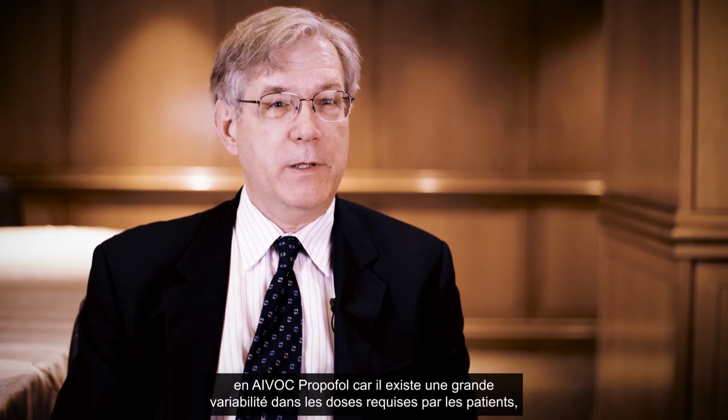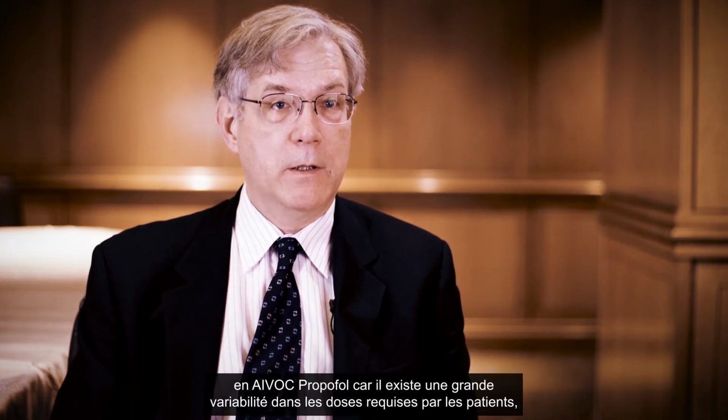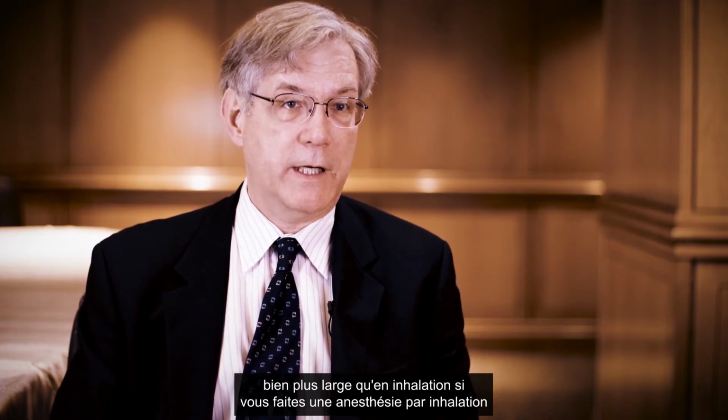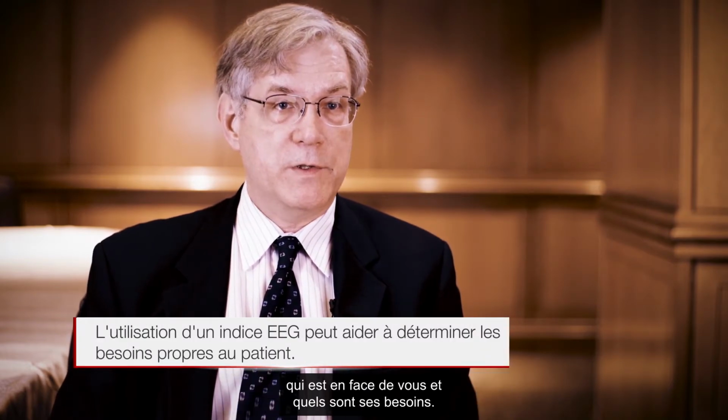I believe it's necessary to use processed EEG monitoring when you're doing a propofol TIVA anesthetic because there's a wide patient variability in dose requirement, much wider than, say, an inhalational agent if you're doing an inhalational anesthetic. And so using the processed EEG variable allows you to more specifically understand who's in front of you and what their requirements are.